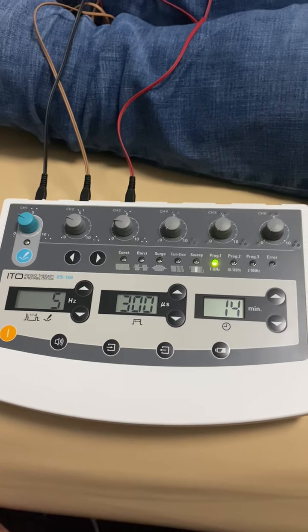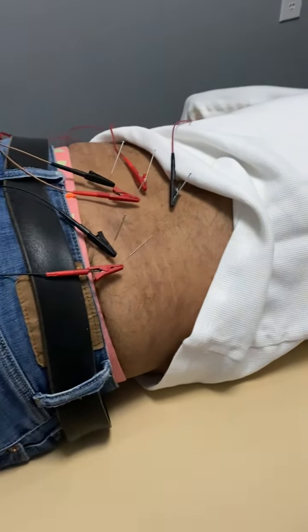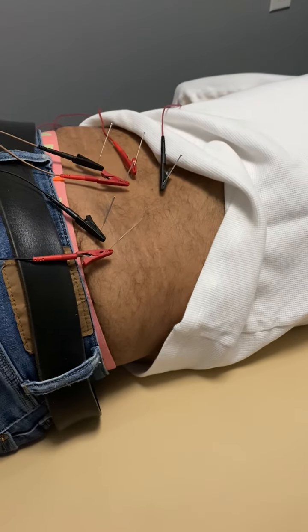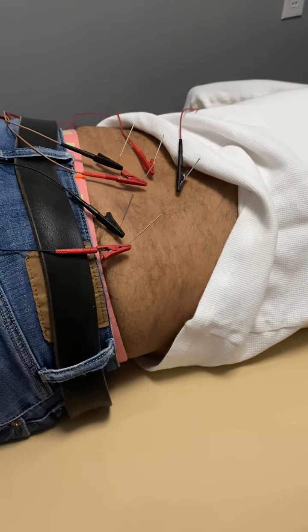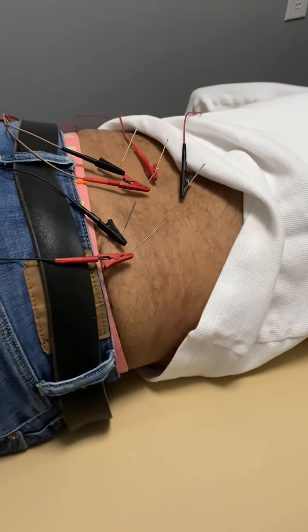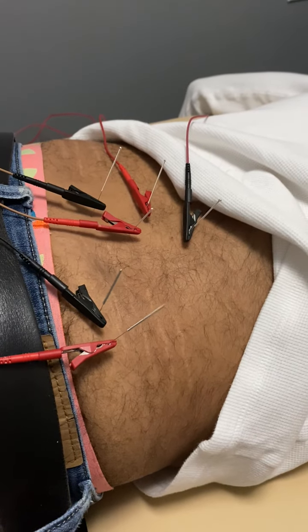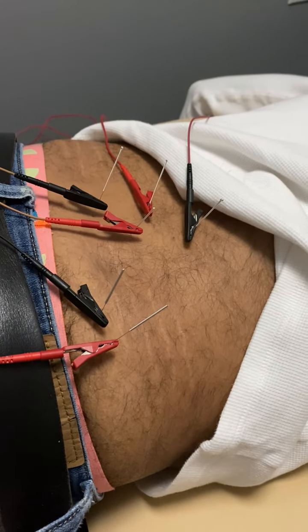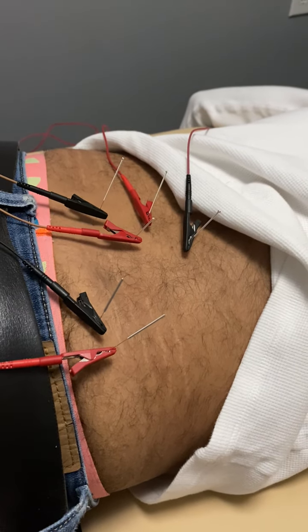It's much more variable and creates a much more comfortable stim. It also lets us do setups like this — we're able to stim every point along the kinetic chain, which is a game-changer for our patients. You can actually see the needles reacting to the twitches of the muscles underneath.